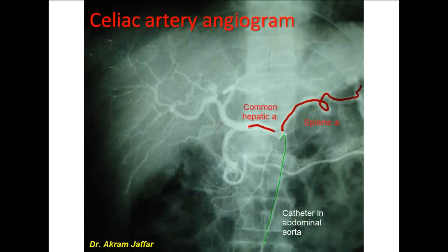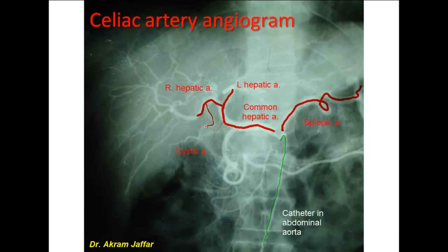The common hepatic artery continues as the proper hepatic artery. The proper hepatic artery divides into a left hepatic and a right hepatic branch. You can see here that the right hepatic artery provides a small branch — the cystic artery — that supplies the gallbladder.